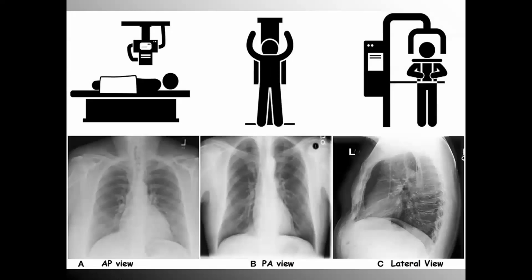Most of what we would likely encounter in acute care would be an AP chest X-ray when patients are lying facing up, supine in the gurney, and the rad tech comes into the room and slides the film under the patient. And we've all helped with that process if you worked in an ICU, right? In a standard outpatient or clinic environment where patients tend to be ambulatory and very mobile, at least some, they can be more easily or creatively positioned, as shown for the standing avatar here in the picture.